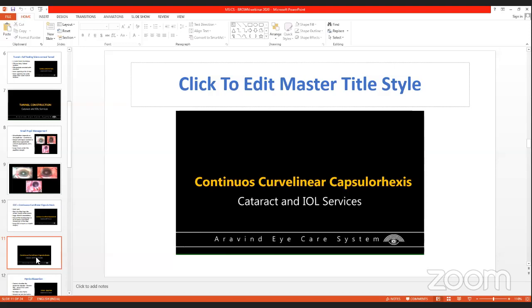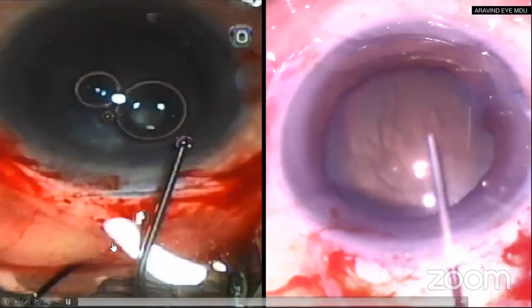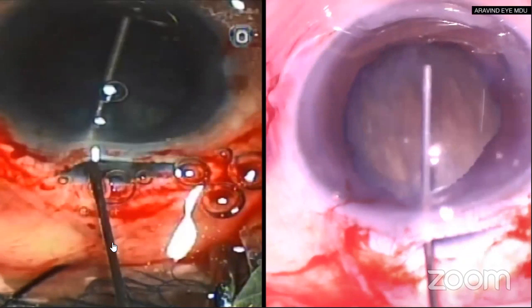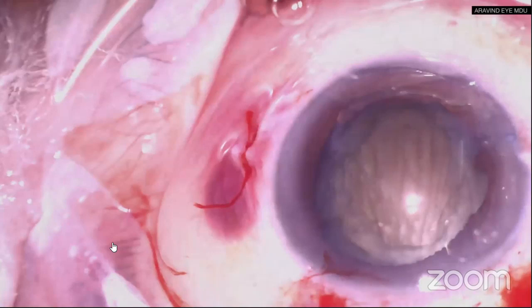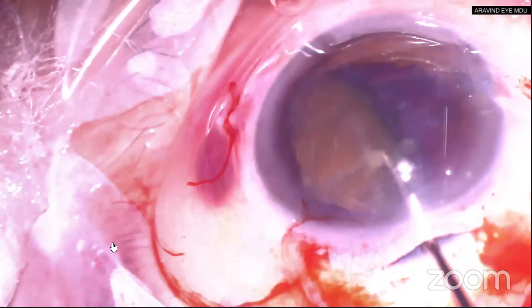Hydrodissection again. Here it is important that we do not concentrate on prolapsing the nucleus. Our aim is to just mobilize or free the nucleus from its adhesions to the bag. Here you can see me performing multiple hydrodissections. This is to safeguard against the fact that the posterior capsule is not visible and we might rupture any posterior polar cataract adhesion or any other adhesion along the back. As you can see, once the nucleus is mobile, it can be lifted freely using a Sinskey cannula. Again, the importance is having a large rhexis and multiple gentle hydrodissections.